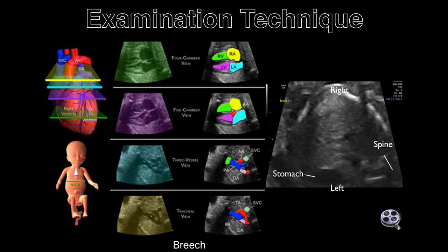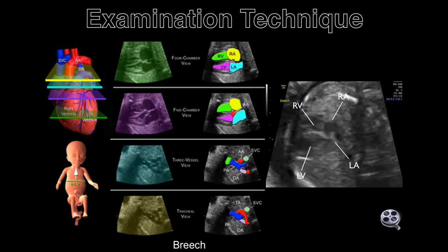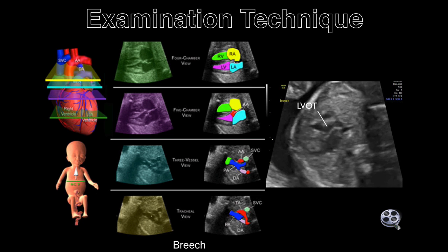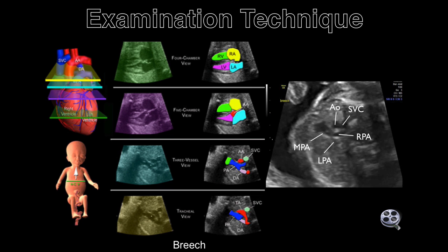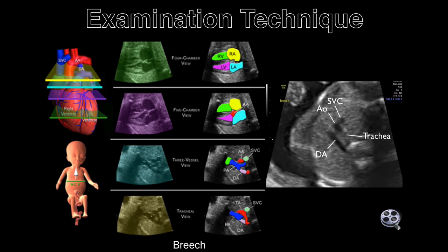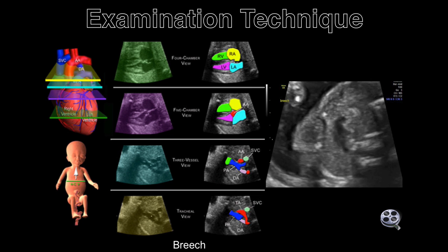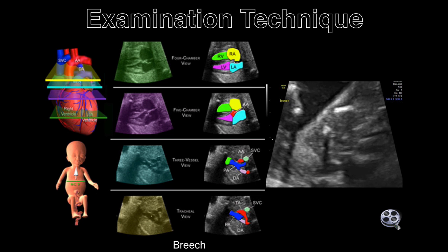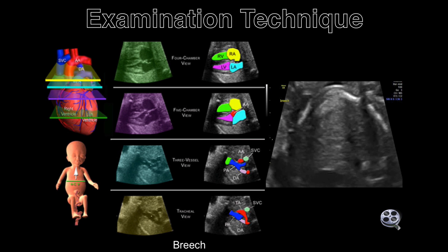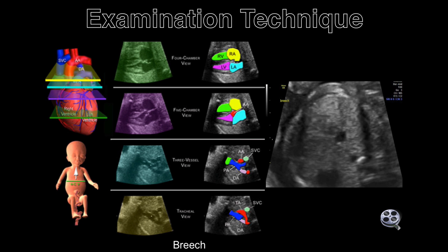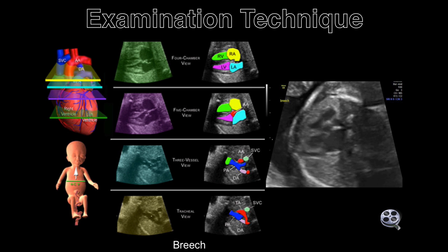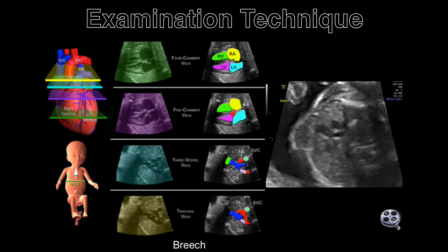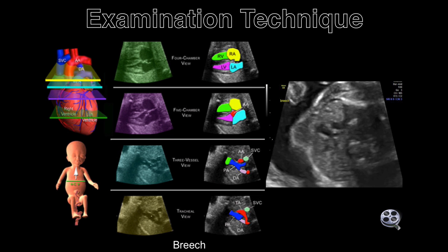4. The tracheal view. This demonstrates the ductus arteriosus and the transverse aortic arch forming a V as they enter the thoracic aorta. The trachea is located to the right of the aorta. Abnormalities of this view identify coarctation of the aorta, hypoplastic aortic arch, as well as other malformations.